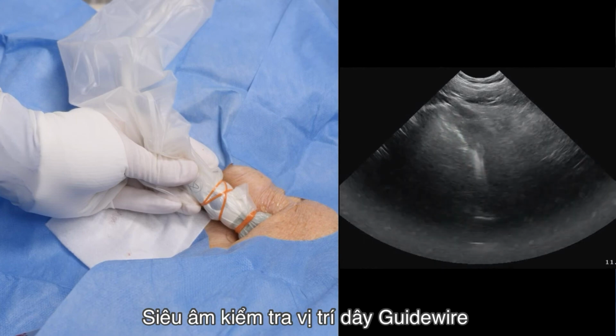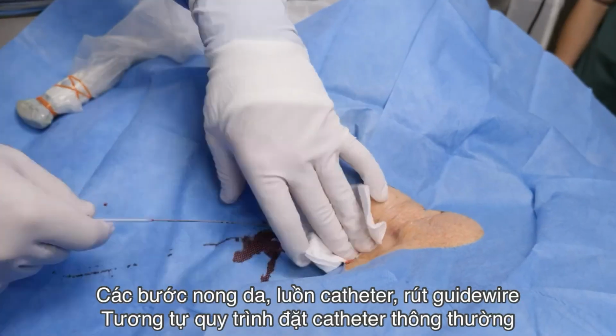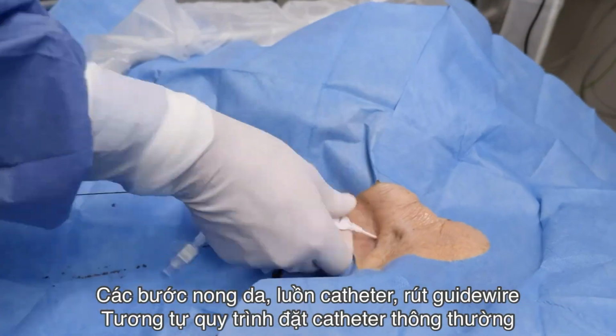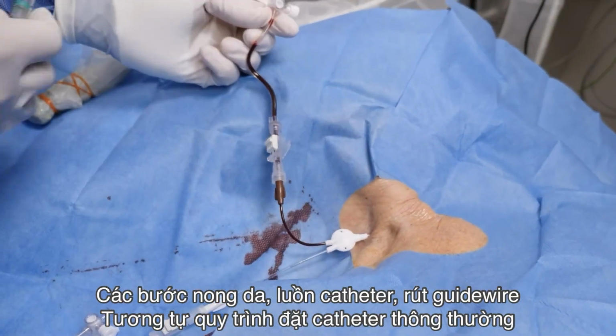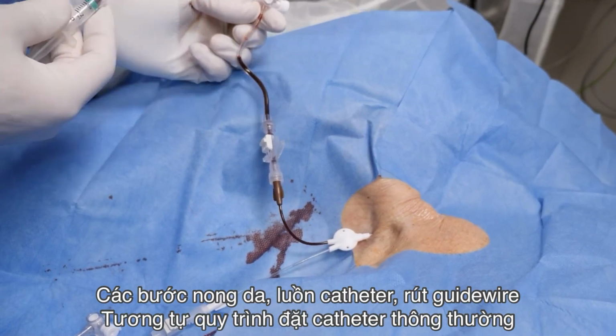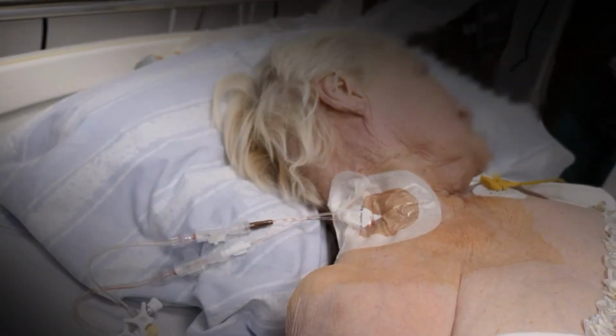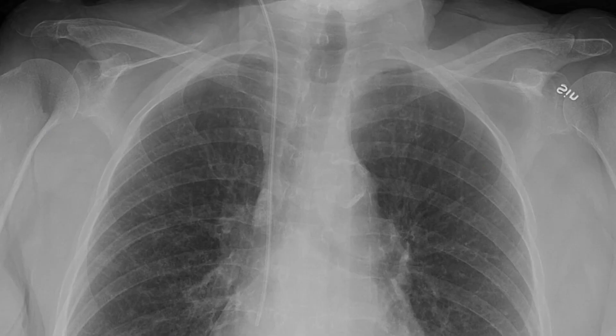In our opinion, this confirmation of the guide wire position is the main advantage of the microconvex probe. Proceed with the central line in the usual manner and further confirm the vein's placement by observing the height of a non-pulsatile blood column. We're currently performing a validation study where we hope to show that the post-procedure X-ray is redundant if correct in-plane technique is used and the guide wire position is verified with this method.